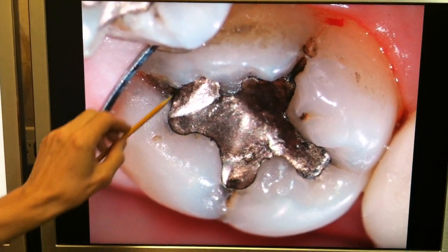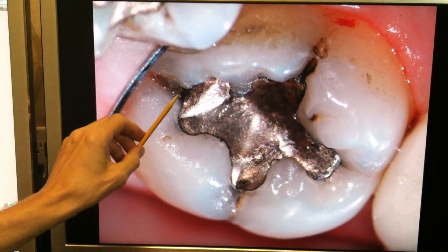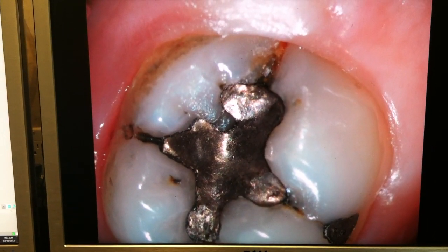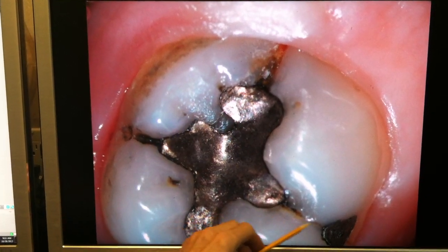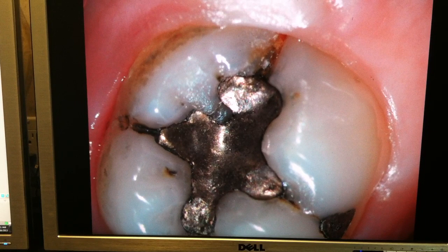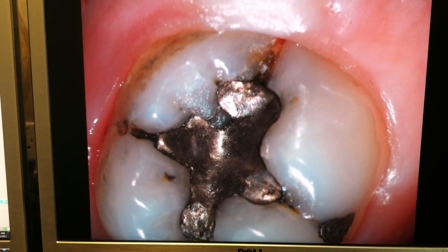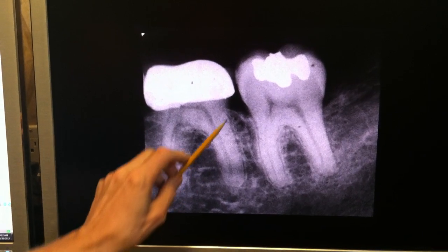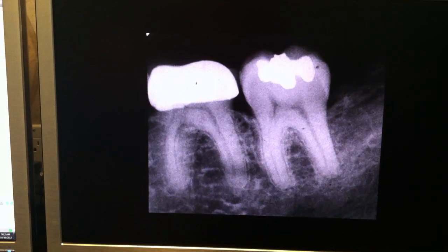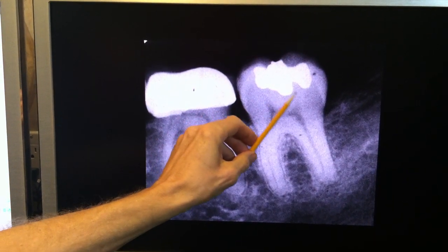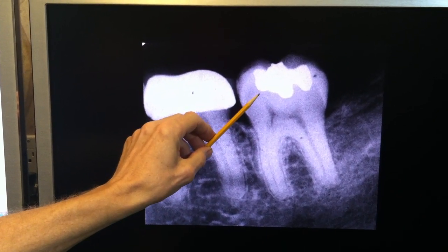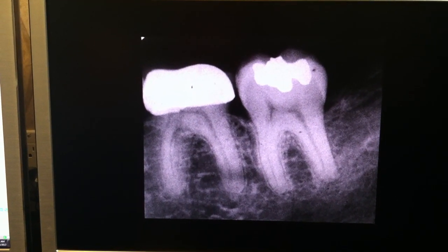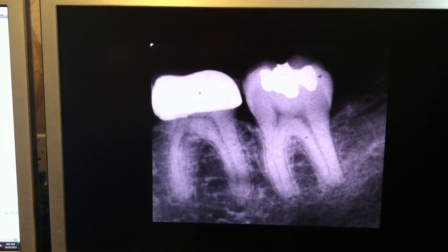This second case is very similar — a large silver filling with a fracture on the front and quite a large fracture on the back, at least it looks worse clinically. Viewing the tooth from a different angle, we can see a fracture coming down here. We don't know exactly what's happening underneath until we take the restorations out. A common question is whether you can see the fracture on the X-ray, but you really can't, because the film cannot resolve the crack. We take X-rays for different reasons, other than to see the fractures.